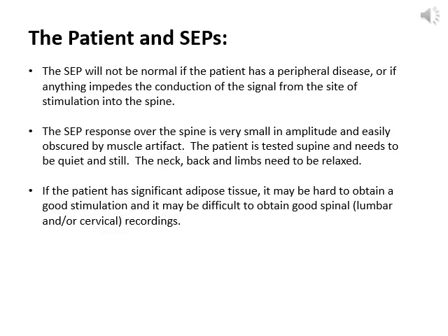The SEP will not be normal. It cannot be normal if the patient has a peripheral disease such as a peripheral neuropathy, or if there is anything that impedes the conduction of the signal from the site of stimulation into the spine. This will affect the entire SEP.